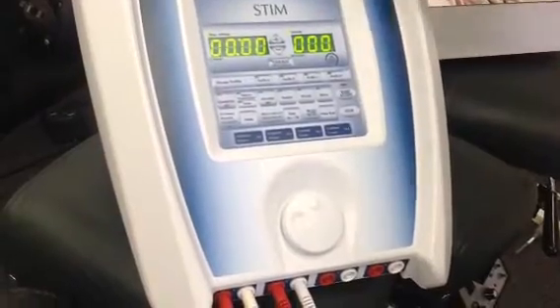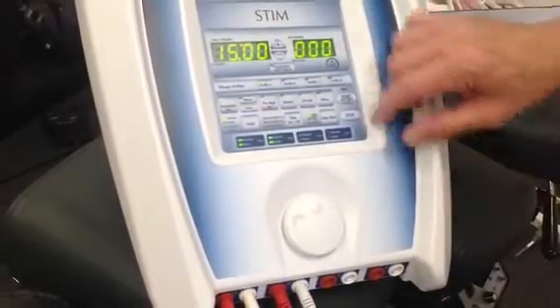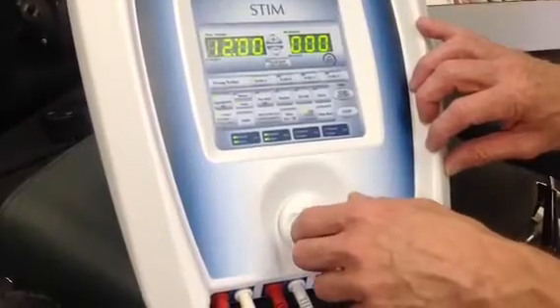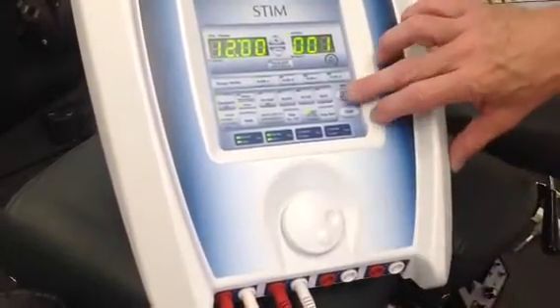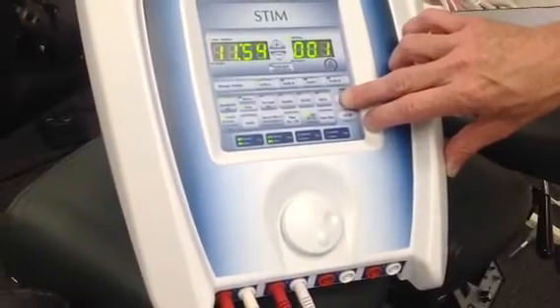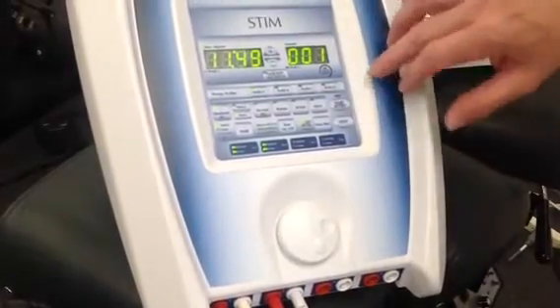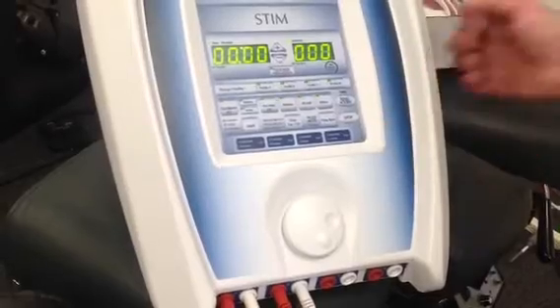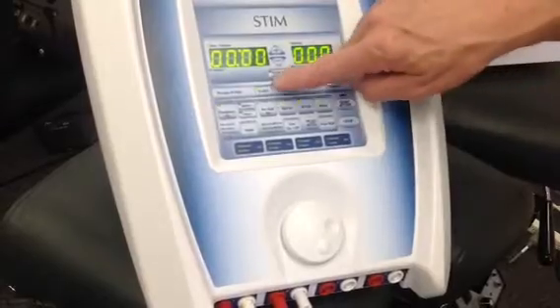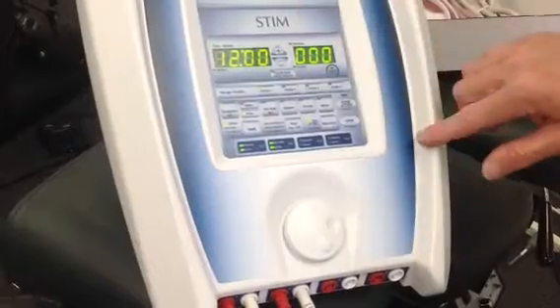We've just turned the machine on and hit Profile A twice. I'm going to choose quadripolar. I'm going to choose 12 minutes because most people do quadripolar. I'm going to turn up the intensity and hold this down for two of those sounds. Okay, I held down the Start Accept button. Now I can turn it off and turn it back on again. When I push Profile A, we should go to quadripolar and 12 minutes. So that's how you program it.